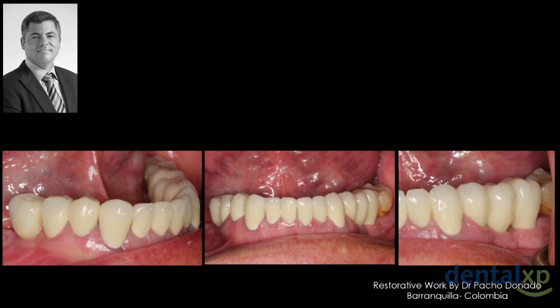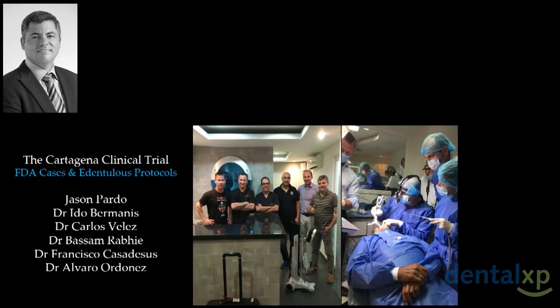And the whole idea is that we incorporate technologies that are going to make us better and going to make more beautiful work. So we need to have somebody to help us with this part because it takes time. So if you are milling in your office, remember, you have to spend some time in the glazing and stain.